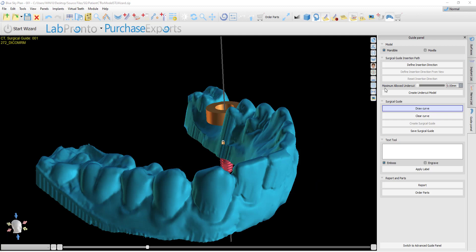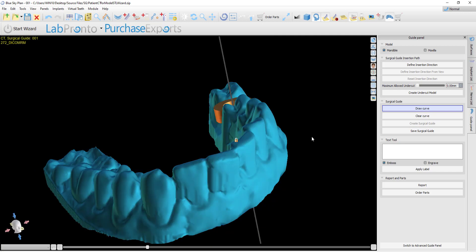We have also added the slider for maximum allowed undercuts. In the vast majority of situations, this value should be kept at zero, which means that no undercuts should be allowed and all undercuts should be removed. Raising the slider changes the value of the allowed undercuts — if we change it to one millimeter, that means the software will allow one millimeter of undercuts to exist. In the vast majority of situations, the value should be kept at zero and you should proceed to defining the insertion path and drawing the curve with the value at zero.